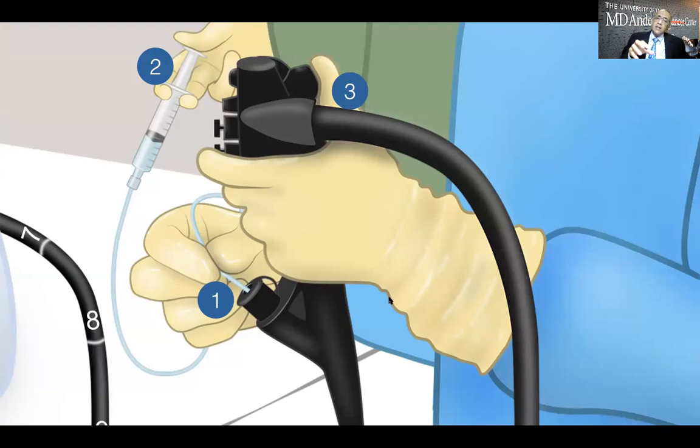And as you find that the needle is in the submucosa, then you look up with your up-down knob, looking up, and then pulling your needle back so that the submucosa fills up. Typically, I inject in one spot for a 10-20 millimeter lesion and direct my needle in whatever direction I want so that I get a good lift and make that lift come in such a way that I don't have to struggle with my snare for resection.